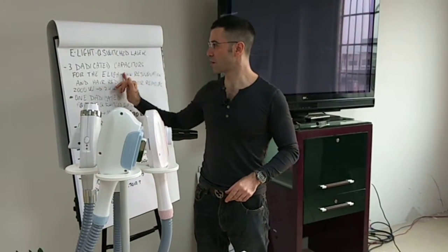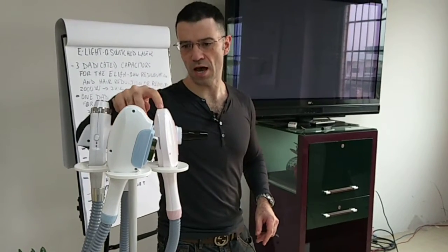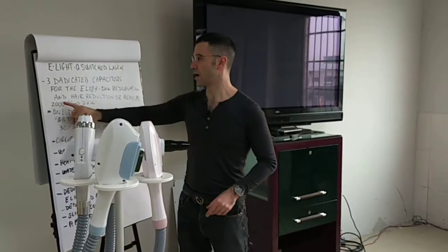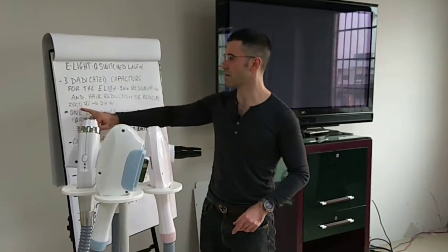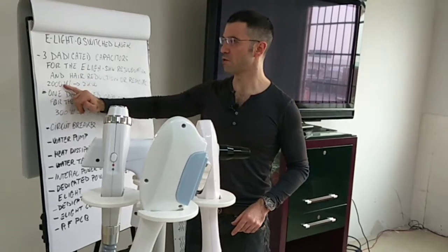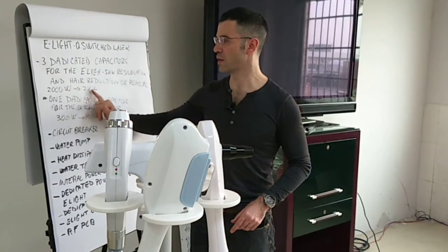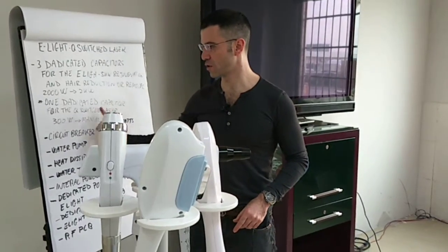3 dedicated large capacitors for the E-Light, both the rejuvenation and the hair removal, if I remember well. Because one is the rejuvenation, the other one is the hair removal. I can't remember exactly which one is which right now. And the overall power is 2 kilowatts. Then we've got a dedicated capacitor for the Q-switch laser.